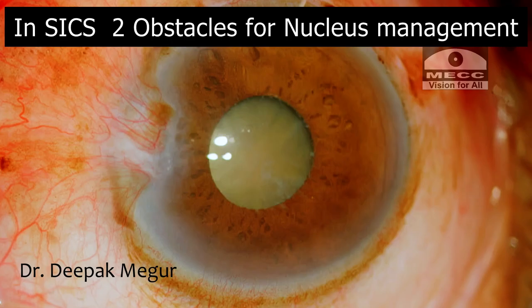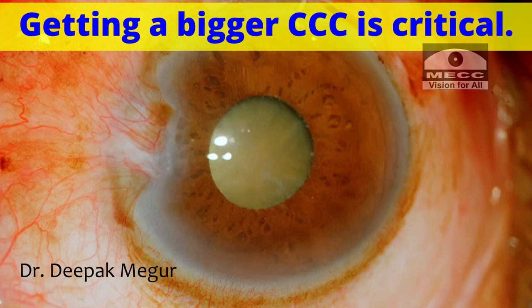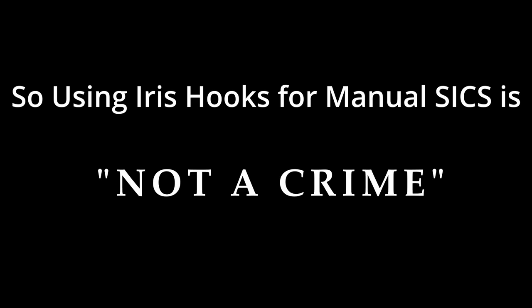Let us remember that in SICS there are two distinct obstacles for nucleus management: the rhexis and the pupil. We all know that getting a bigger rhexis is critical, and having a bigger pupil simply eases the job. So let us be sensible and use devices to expand the pupil. Many surgeons don't use iris hooks, but using iris hooks in manual SICS should not be considered a taboo. Thank you for your attention.